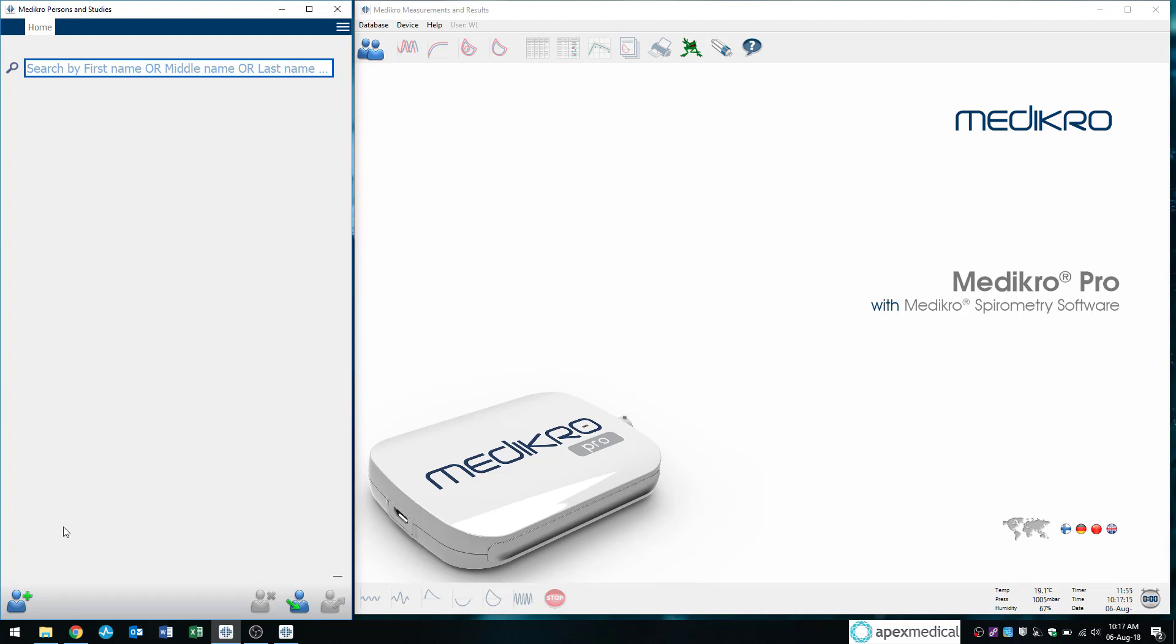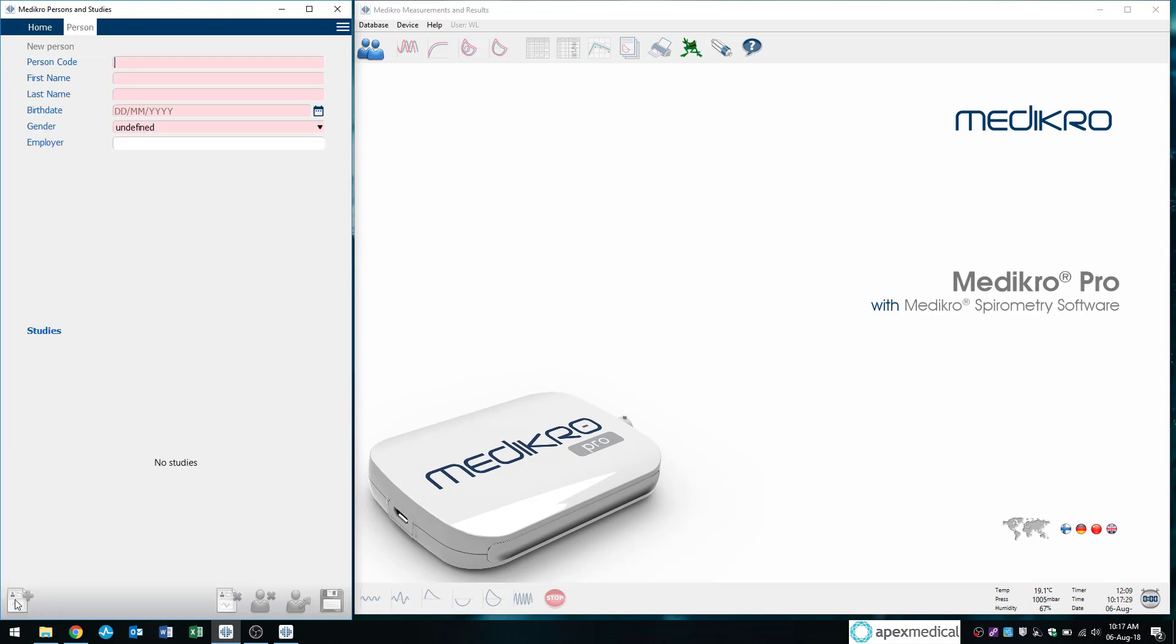Once again, if you do forget what any of these buttons do, hover your mouse over it and it will tell you. So here it says new person. So this is where I start a new test. So I'll click on that once and it's going to bring up some fields.